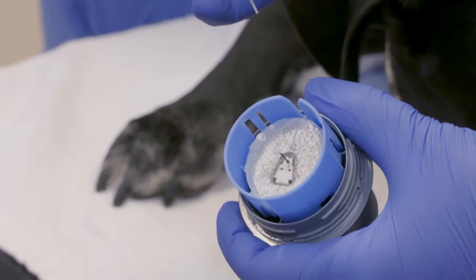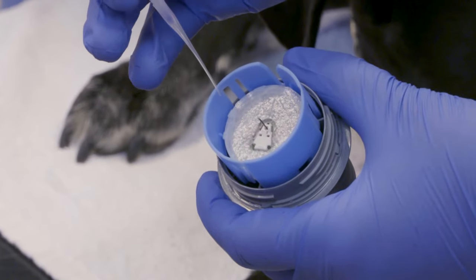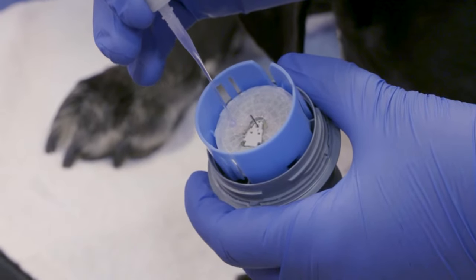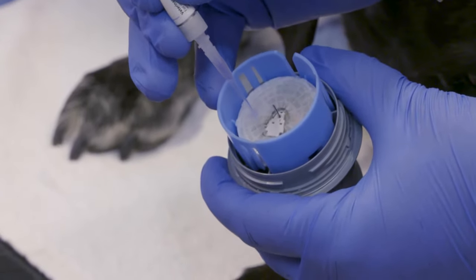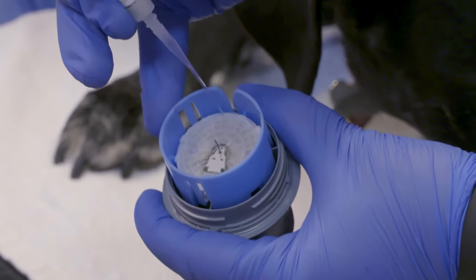Once the applicator is deployed, the needle inserts this filament under the skin and then retracts back into the applicator. The needle does not remain in the patient. Before placing the sensor, it is recommended to place a few drops of tissue glue around the underside of the disc to ensure that it stays adhered to the skin. The applicator is now ready to use.